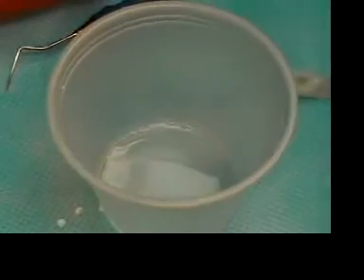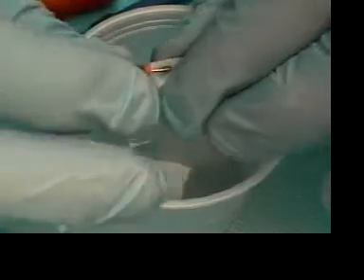And so my goal now in cleaning and shaping is to take the tooth and the files. Since this is my 30 file, I'm going to take my 35 file. Remember, I want to be working through a pool of sodium hypochlorite. The canal is wet, but I want to have a pool of sodium hypochlorite. Take the 35 file and take that and open that and flare that so I can get this down to the step back, which is a half millimeter short. And you can see what a difference, the 30 goes down very well, but the 35 doesn't. That's fine. Go up to the 40. The 40 is now a millimeter short of the working length. I'm going to do some filing.